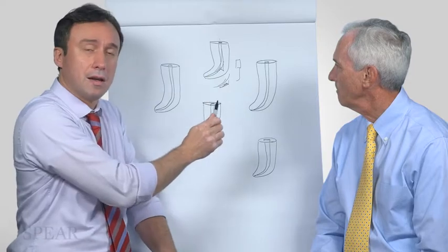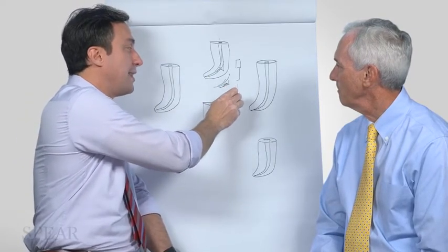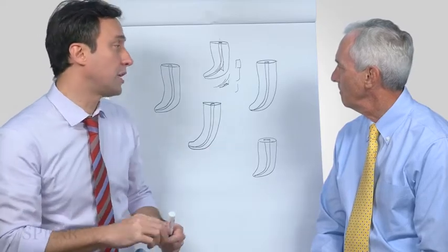If you have an austenitic file that doesn't quite shape, you can actually use ice on it, and then you can bend it, and it'll bend, and you can then get it around that curvature and get that cleaned out. So let's talk about transportation as well.